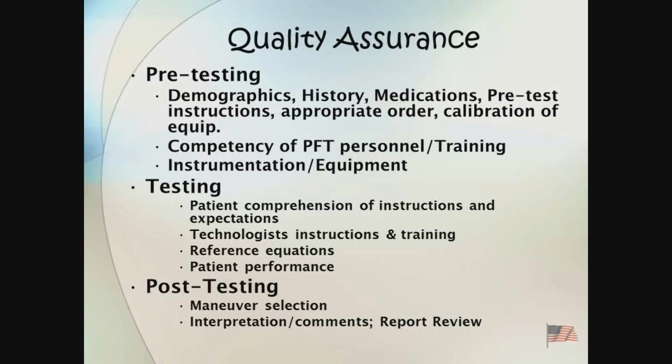Could be pre-test, you want to make sure that the appropriate calibration of equipment and the collection of data on the part of the patient is appropriate. And one of the big ones that involves is the measurement of height. Not asking the patient how tall they are, but physically measuring their height, because we all know that we overestimate our height. It's just a natural thing that we end up doing. And for the same purpose, measuring their weight. Even though it's not part of the predicted values, it is something that should be reported.